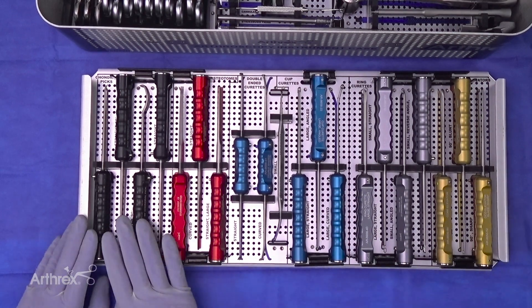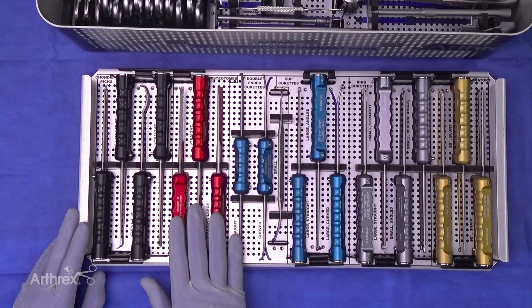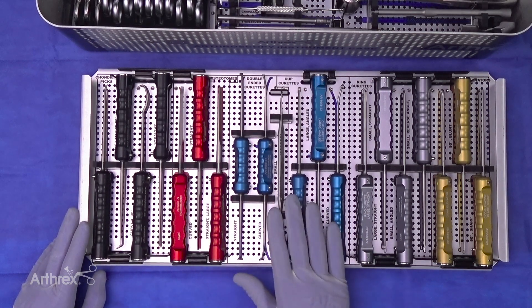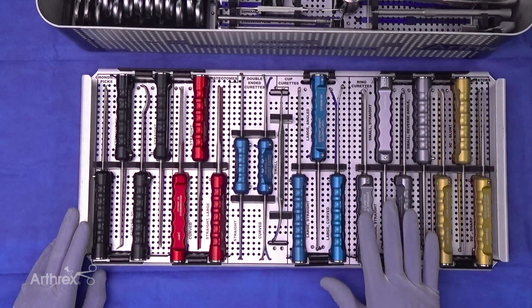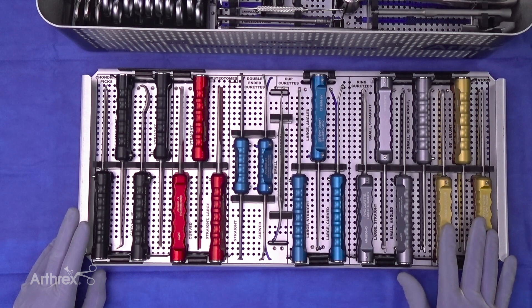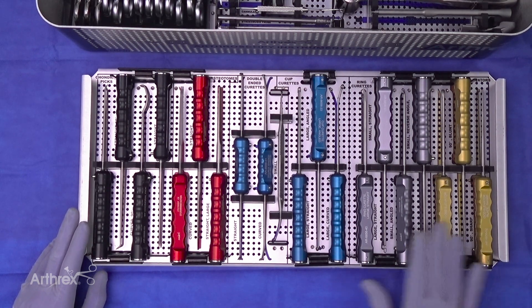Every instrument is color-coordinated: chondral pics are black-handled, osteotomes are red-handled, the various curettes have a blue handle, ring curettes have a silver handle, and the elevators are in gold. The first thing I want to highlight are these microfracture pics.